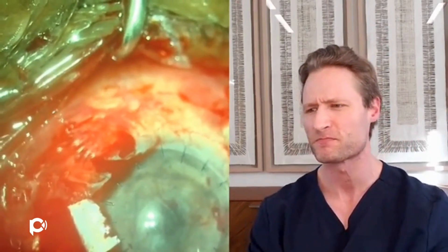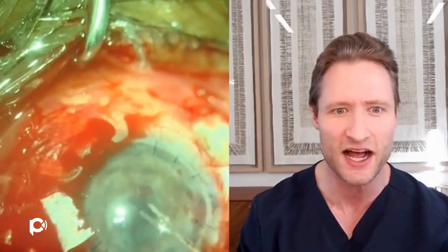I'm using not only a cyclo-dialysis spatula, but also a 30-gauge half-inch sharp needle to penetrate through this membrane overlying the pupillary aperture. You need something sharp because the whole pupil, iris, and into the angle is one continuous sheet of fibrotic membrane. This eye has had many surgeries to try to deepen the chamber and create some conduit for fluid to flow out. Simply deepening the chamber or reforming with viscoelastic is not going to fix the problem — stripping this membrane is not going to fix the problem. You have to get this tissue out of the eye.